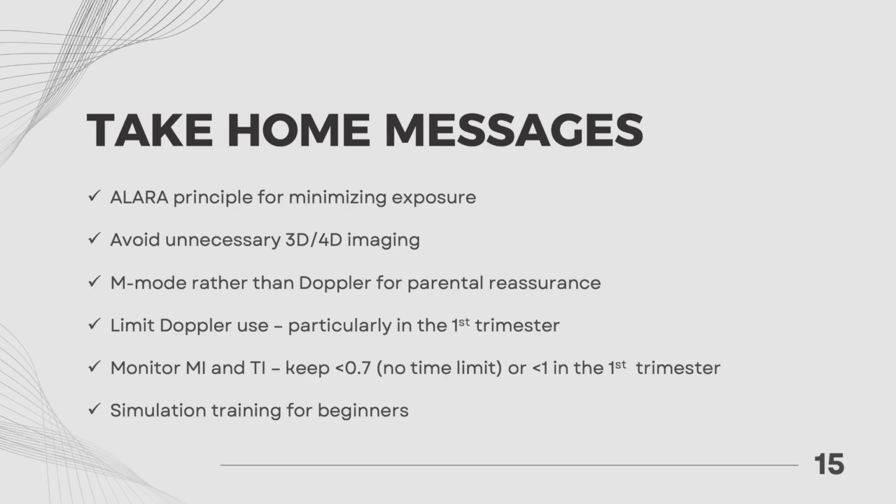M mode is preferred over Doppler for parental reassurance as it confirms fetal cardiac activity while minimizing energy exposure, which also aligns with our ALARA safety principles. On the same note, Doppler use should be strictly limited, especially in the first trimester. We should always monitor both the mechanical index and thermal index. The aim is to keep TI below 0.7 or below 1 with a time limit of 5 to 10 minutes, especially in the first trimester.